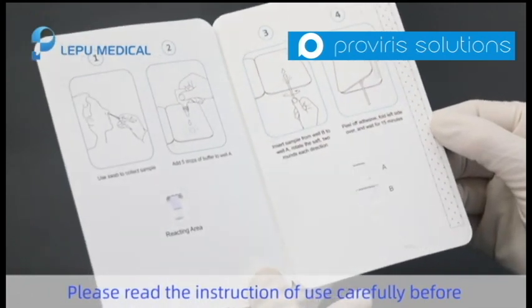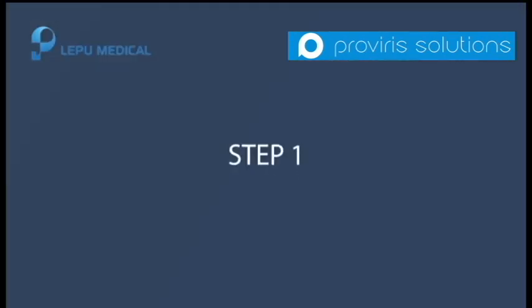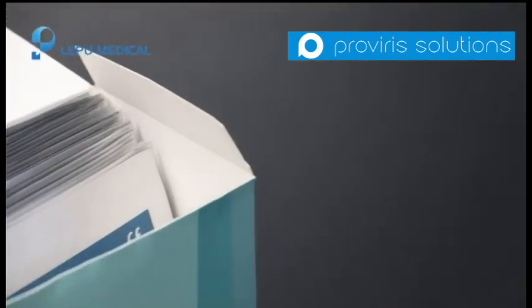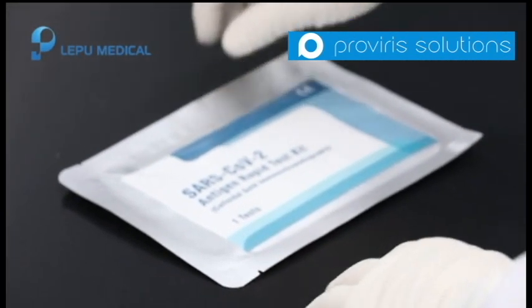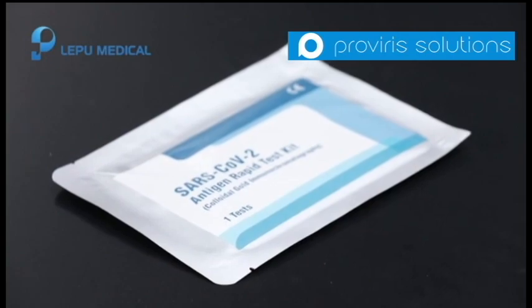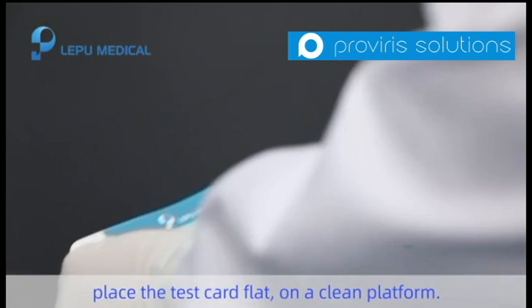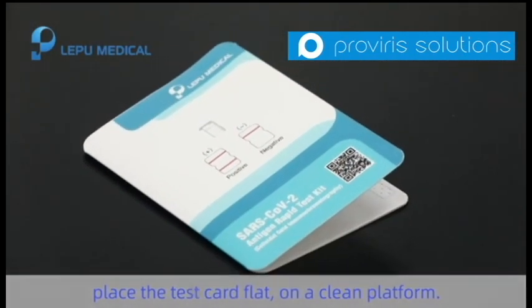Please read the instructions of use carefully before taking a test. Tear off the sealed inner package and take out the test card. Place the test card flat on a clean platform.